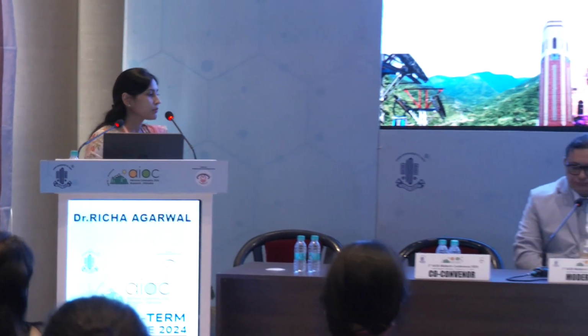Barrett's 2 has the advantage because it uses multiple parameters, not just 2 parameters. Maybe people who are still using ultrasonic biometers will say that there is no advantage of using Barrett's. However, there are studies which have compared that even with 2 parameters, Barrett's performs much better than the older formulas. So going with Barrett's is always better, whichever machine you're using.